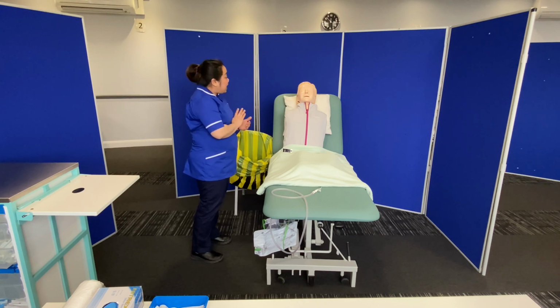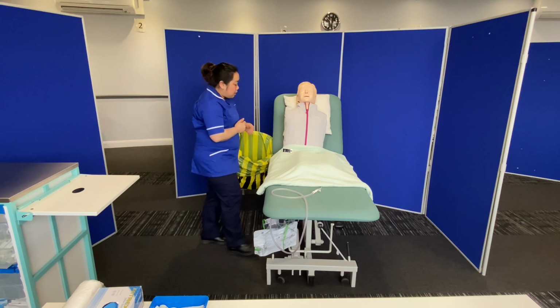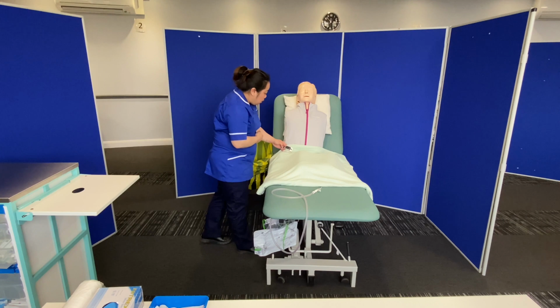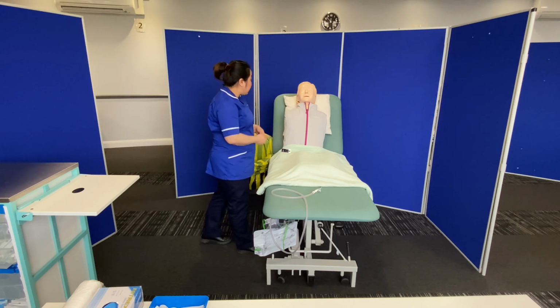Right, so they have advised for me obviously to collect that, but first I must check if I am with the correct patient. So if you will allow me to check your wristband. Yes, you can. Right, okay. Can you tell us your name and date of birth, please? Lindsay Lujan, 1/1/1988. Right, so MRN number is 1234567X. I can confirm that I am with the correct patient, and the CSU is meant for the correct patient as well.